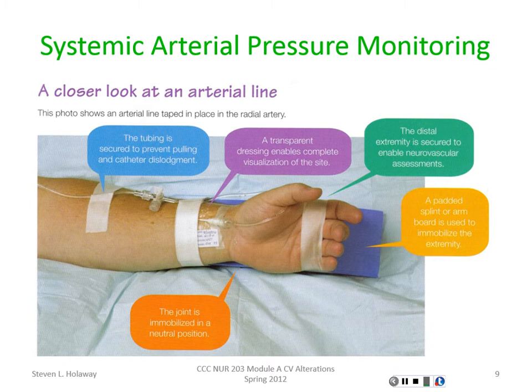I actually went into a room and got there in time. Someone had left the stopcock open at the transducer site. The blood had backed up from the art line all the way back up, was at the transducer and beginning to come out at the stopcock near the transducer. They just didn't get it pushed all the way over. So luckily, I happened to walk in at the right time for that patient. But those are things you have to be aware of.